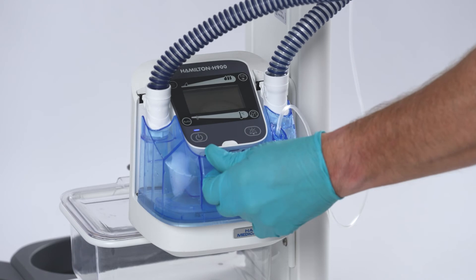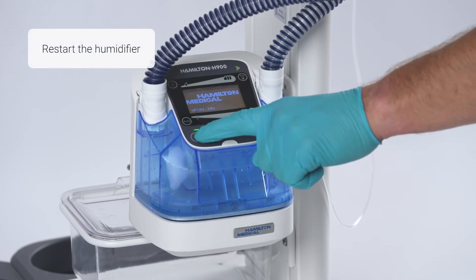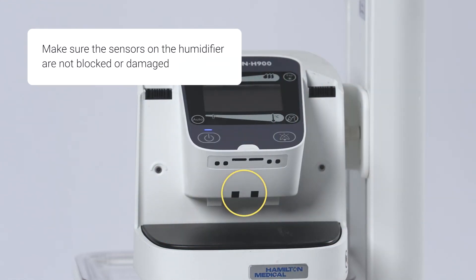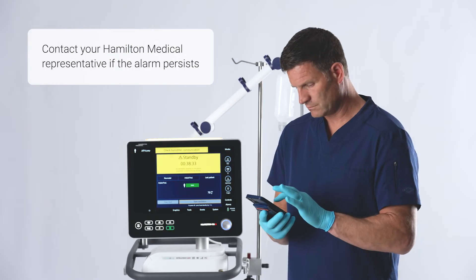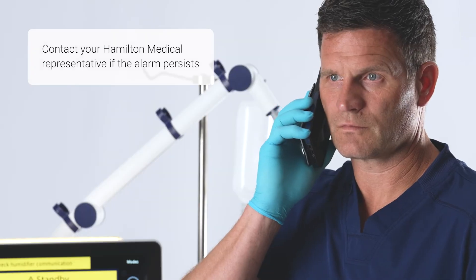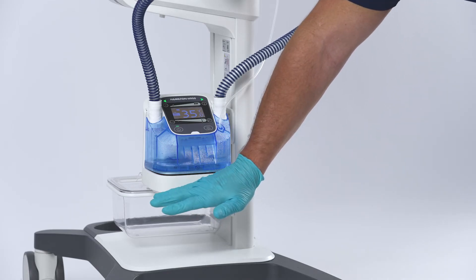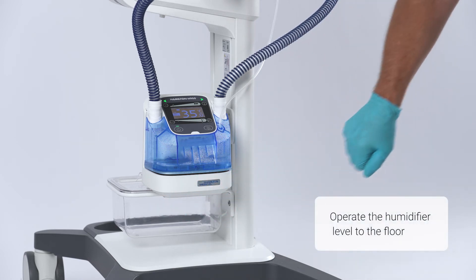After you have taken corrective action, restart the humidifier and see if the alarm has stopped. If not, make sure the sensors on the humidifier are not blocked or damaged. If the Hamilton H900 alarms again, please contact your Hamilton medical representative. Sometimes the position on the humidifier is incorrect — make sure you always operate the humidifier in a horizontal position.